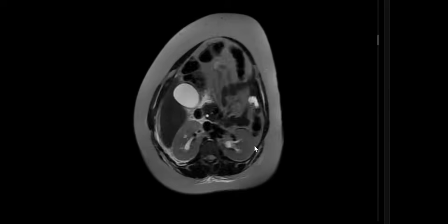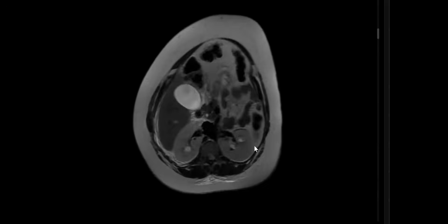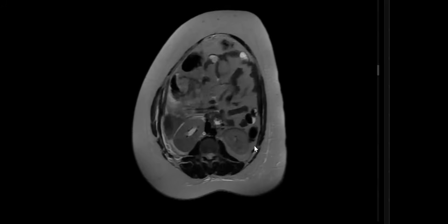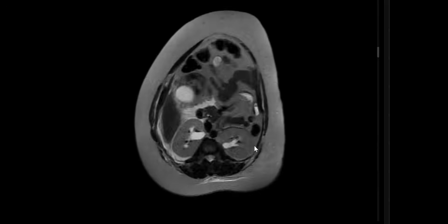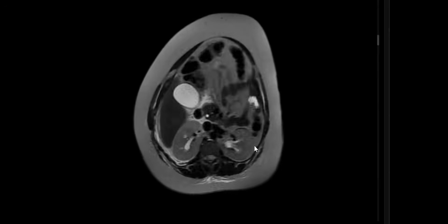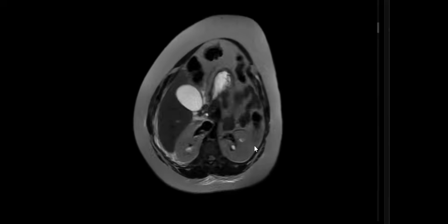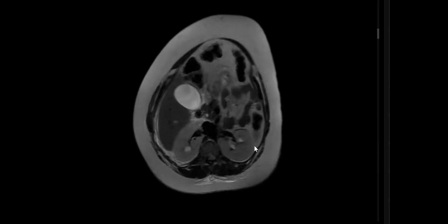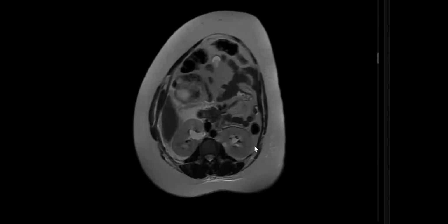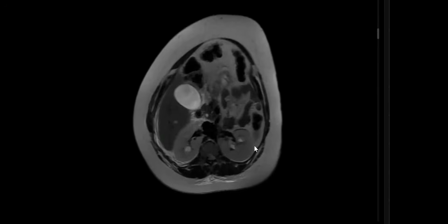Here I can see the liver appears unremarkable, and the gallbladder is quite distended as the patient has right pain. I'm looking at mild back pressure changes, but usually symmetrical, because pregnancy-induced hydronephrosis is a common cause of right-sided pain, as most of the uteri are dextrorotated in nature, so they compress the right ureter first. But here it looks symmetrical.